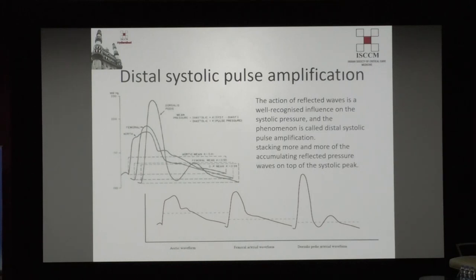Now this phenomenon, in which the reflected waves travel more and more distally, you will see that as they travel more and more distally, these reflected waves are stacked up together, leading to a rise in the systolic peak. This phenomenon is known as distal systolic pulse amplification.